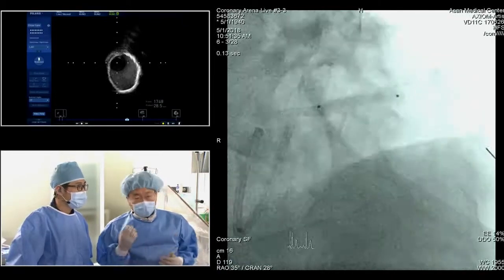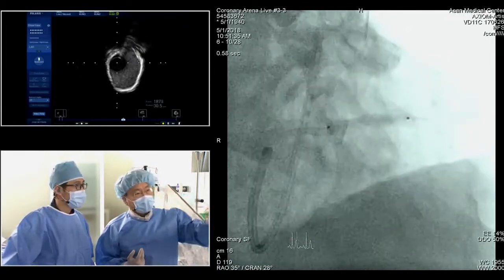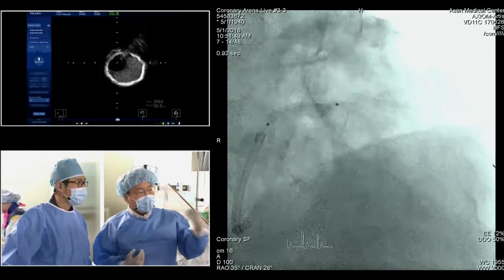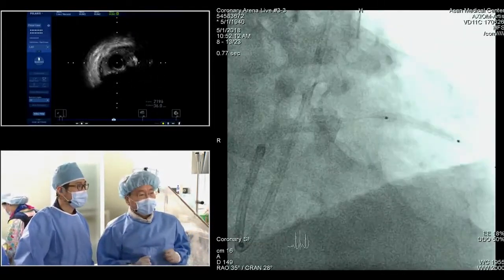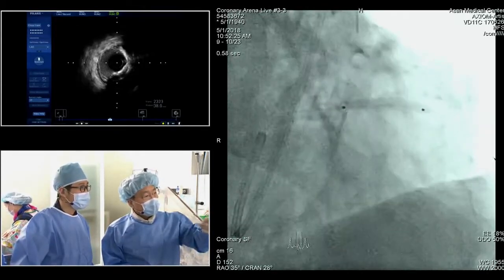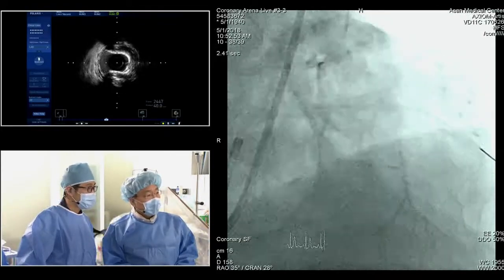So very tough lesions. We recognize that. So high pressure inflation. Using the 3 or another balloon, high pressure inflation, proximal, even including the ostial part. Actually, we have no other options. Unstable status. Okay, go ahead. So we deploy 3.0 non-compliant balloon inflation.